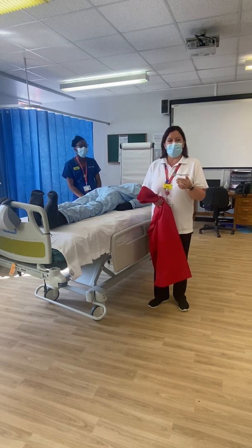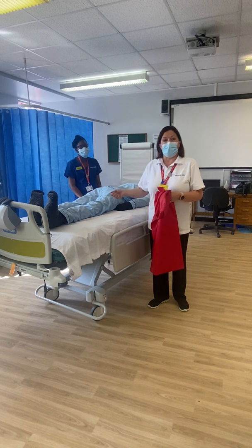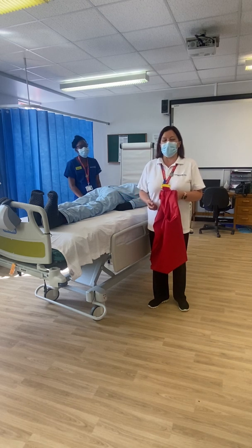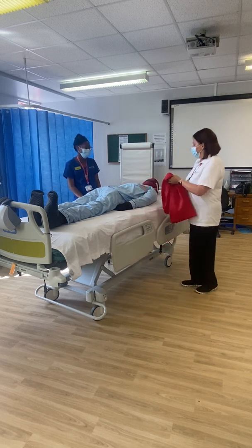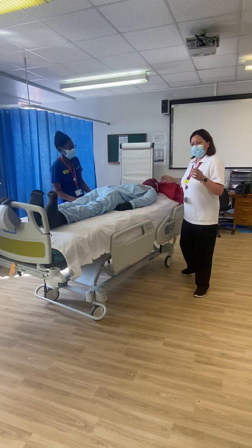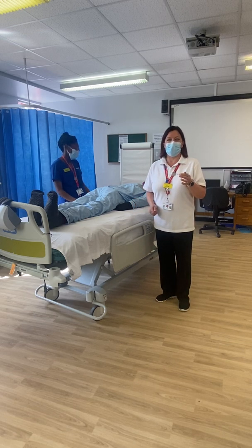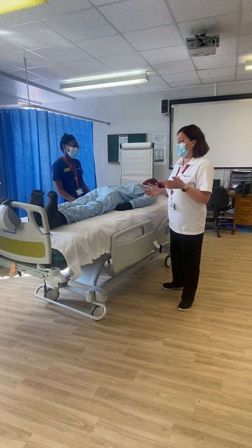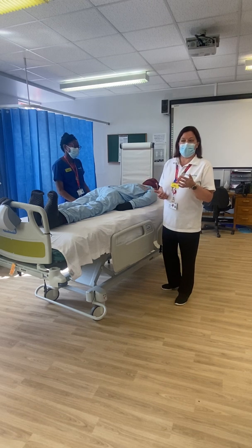We're going to show you two different techniques to actually insert the slide sheet. One will involve rolling the patient, and the other will involve unravelling the slide sheet underneath the patient. So we're just going to demonstrate that to you. Again, it's really important that you communicate with your patient exactly what you're doing. So tell them who you are, tell them what you want to do and what their part in it is, if anything at all.